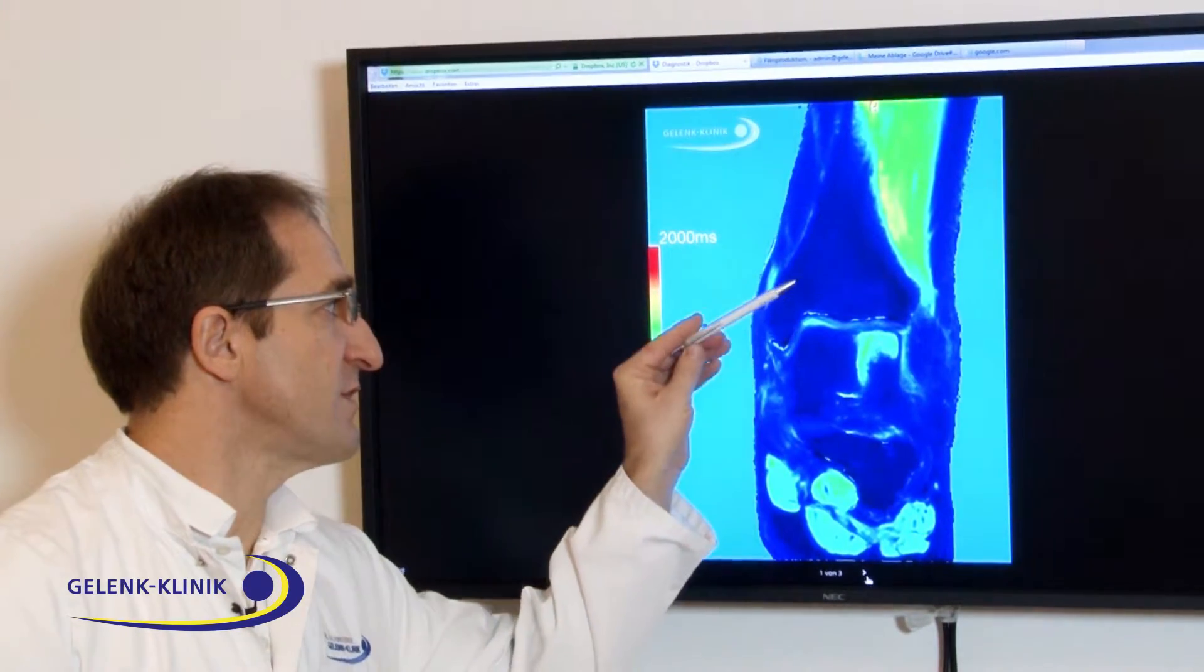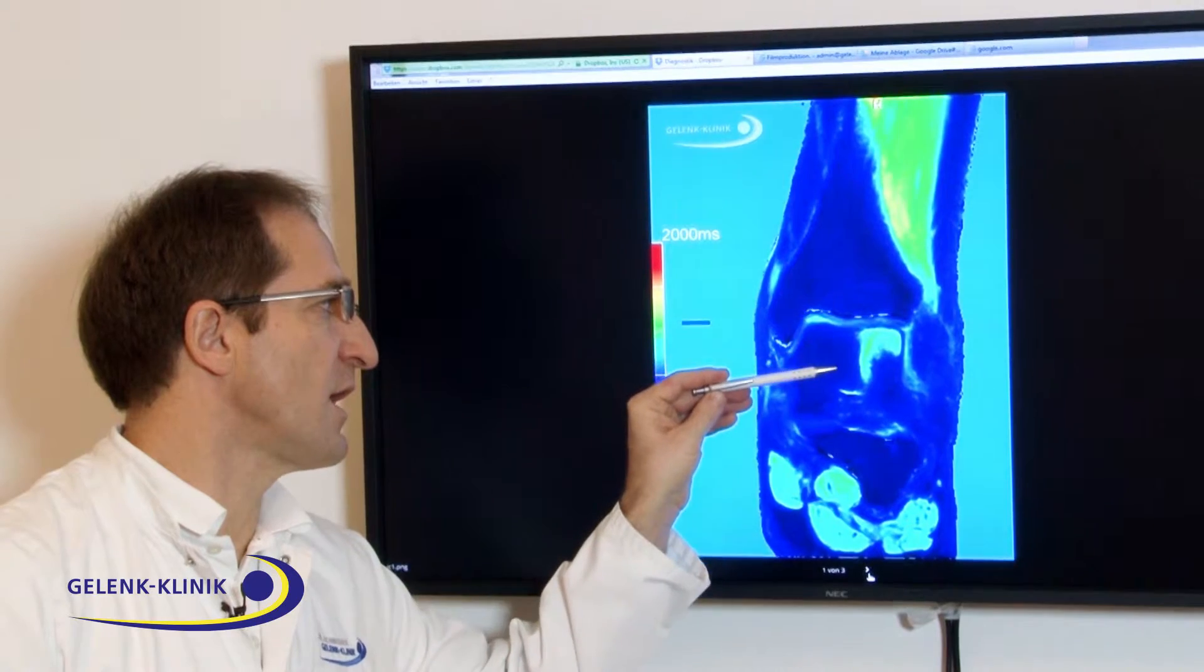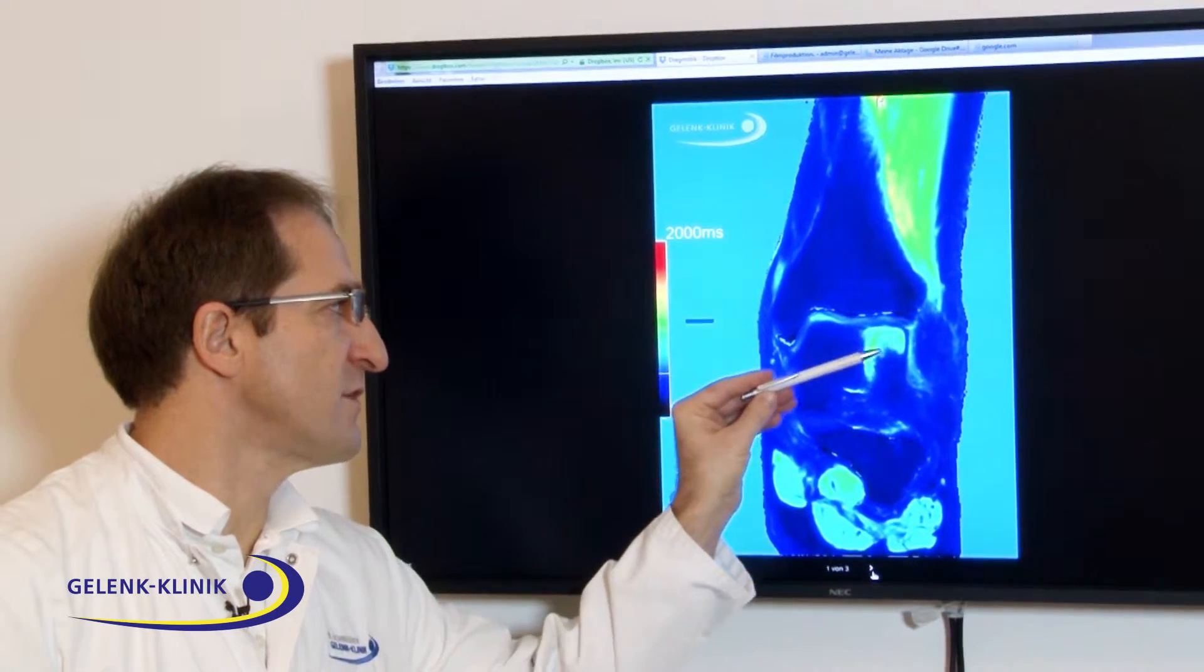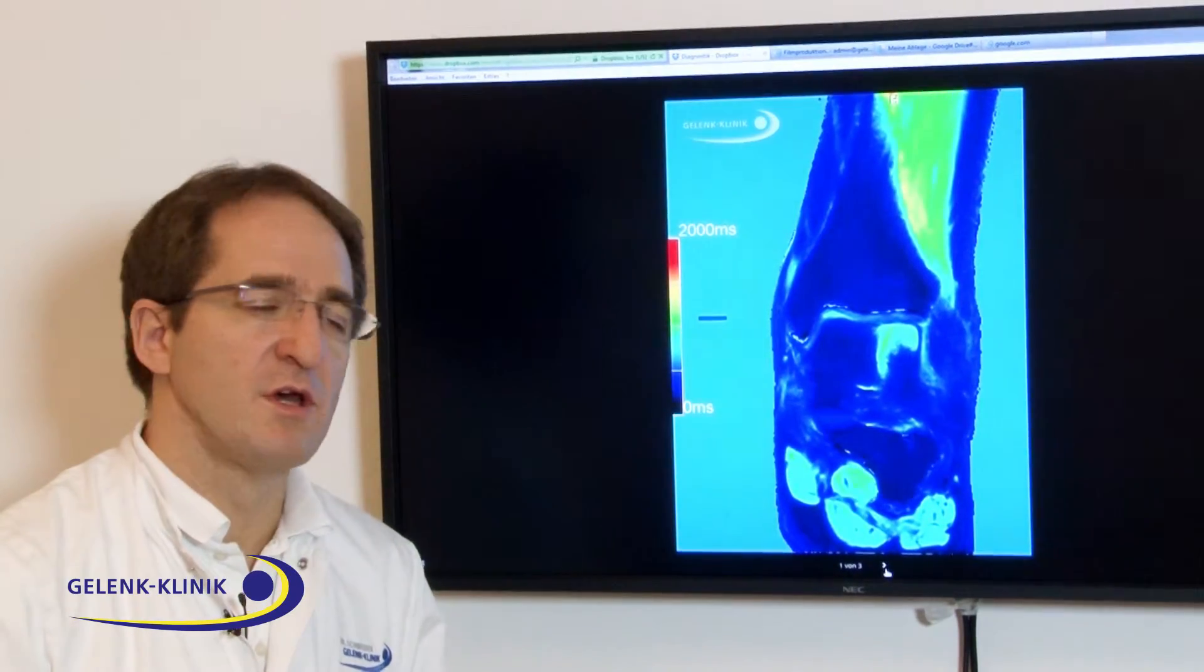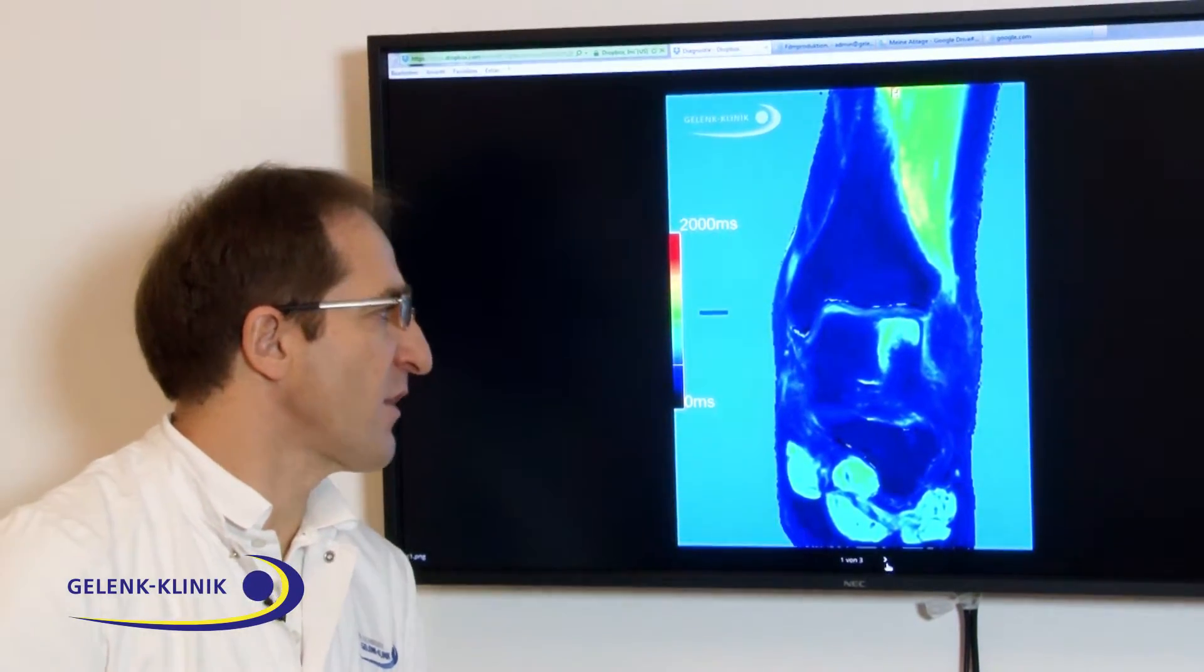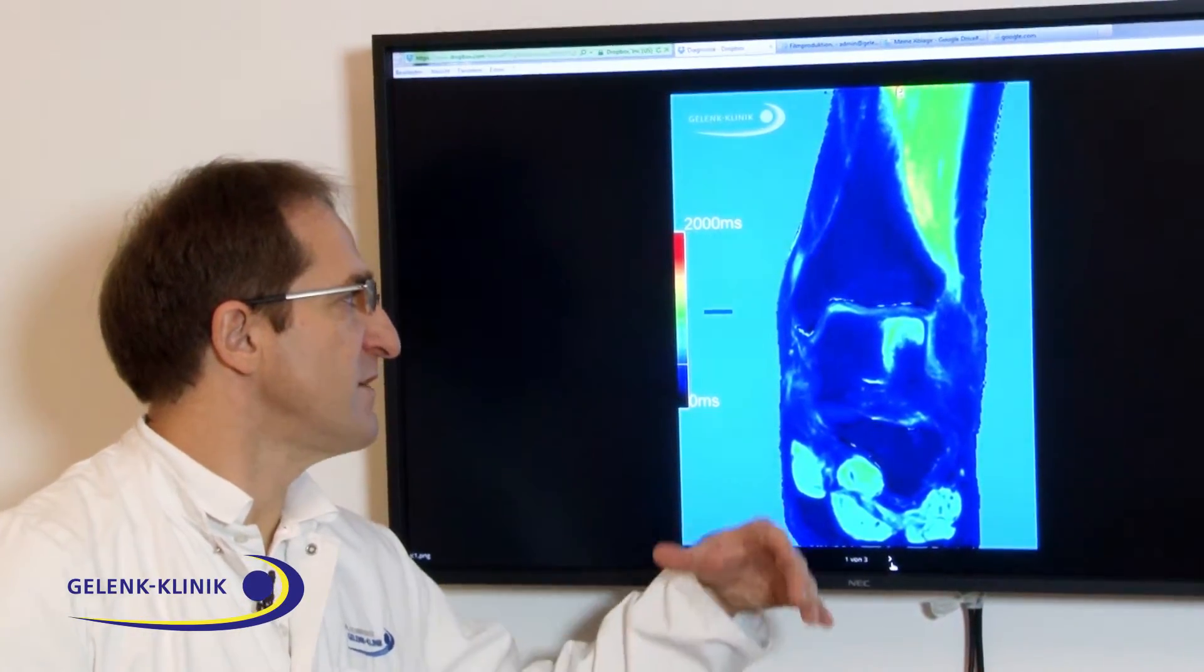On this picture you see the ankle joint, the tibia and the bone of the talus, and you see a cartilage change on the surface of the bone. We can, on another view, always see it in both sides.